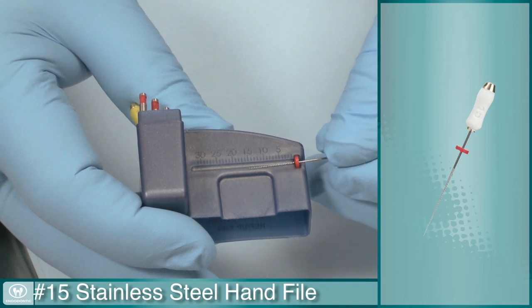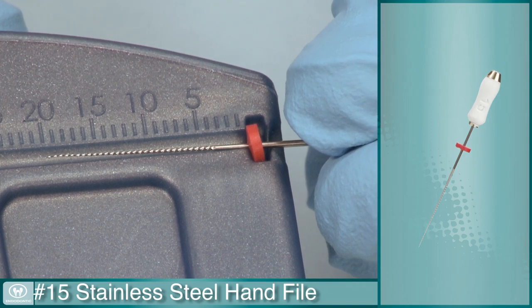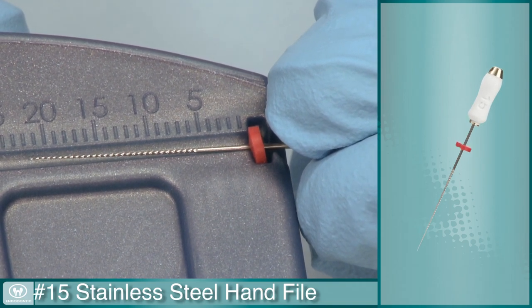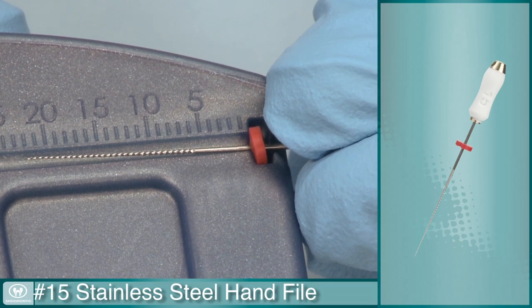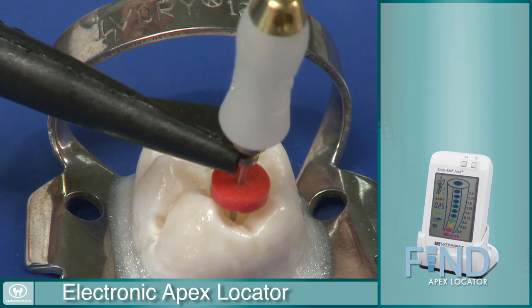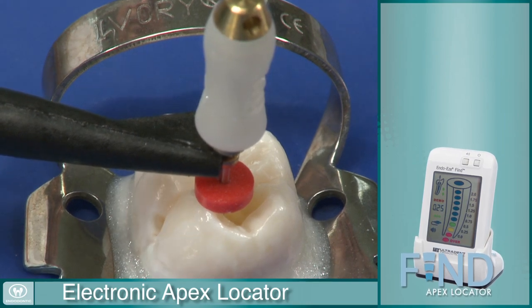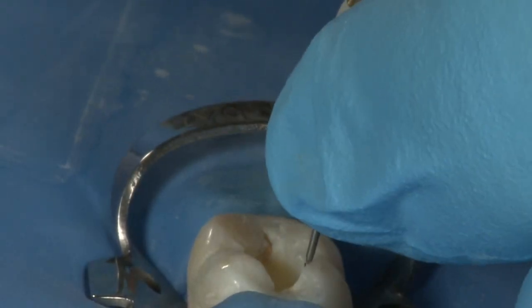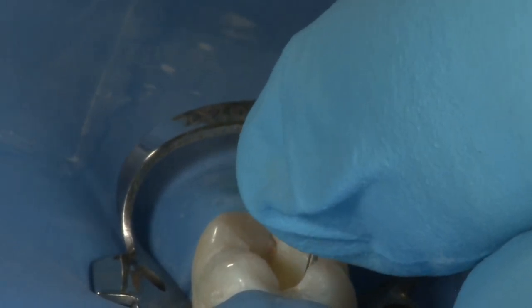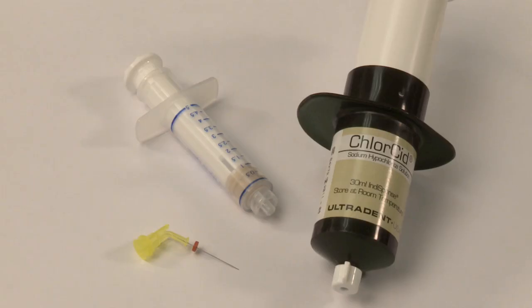Using the number 15 stainless steel hand file, establish intercanal patency by taking the file to about one-half to one millimeter short of the canal length, or where the canal apical constriction is located. An electronic apex locator will give another reference point to determine a precise working length. After finalizing the working length, use a gentle watch-winding motion to work the number 15 hand file until it is loose in the canal.